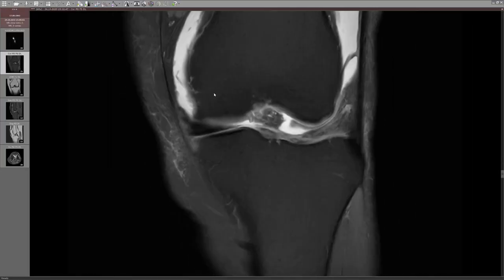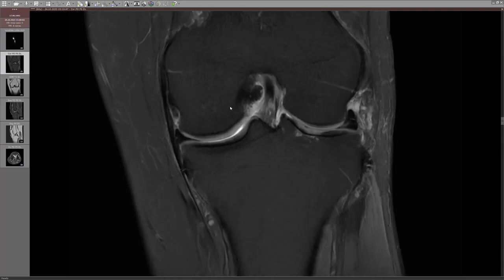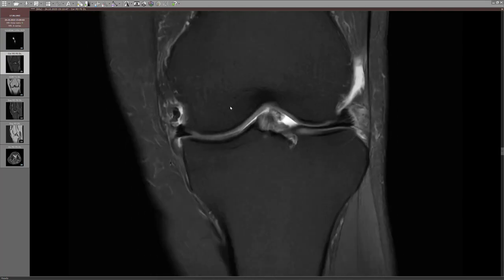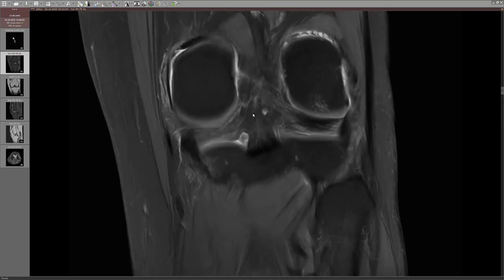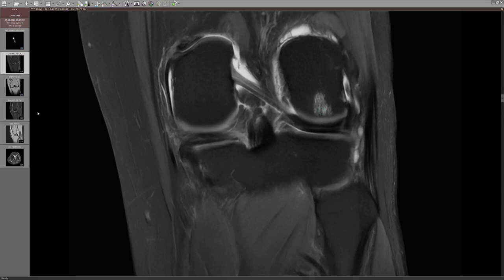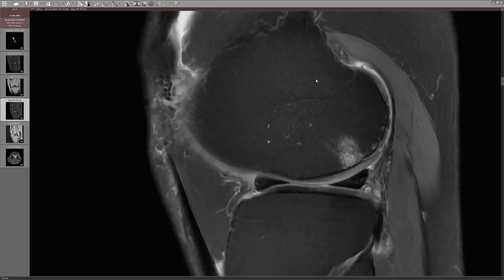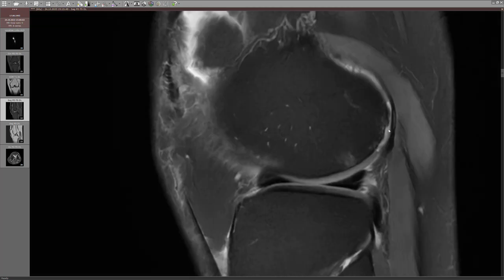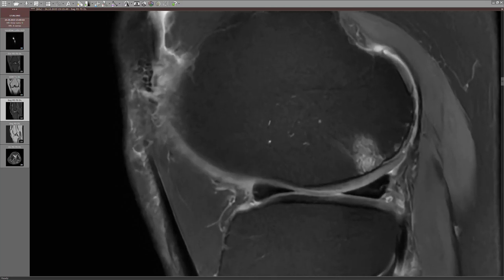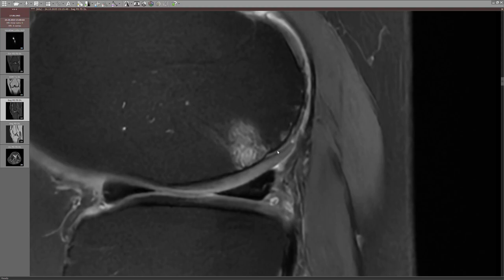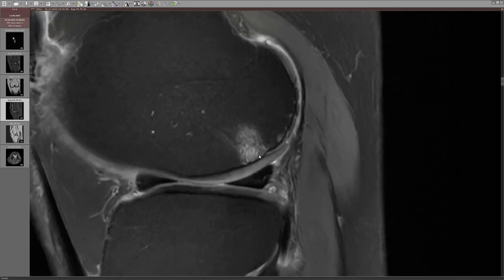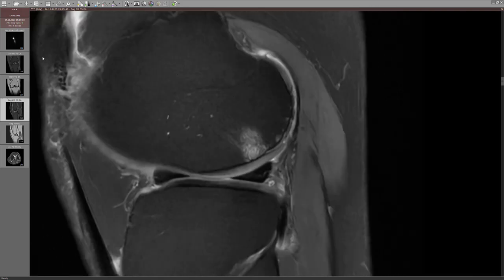Here is the case: this was a younger person who had a fall, then a locking sensation and pain. We did the MRI and there are a couple of findings — a deep cartilage defect on the lateral femoral condyle down to bone, cartilage delamination separating from the subchondral plate, and some bone marrow edema adjacent to it. But these findings are not really what I want to show you today.